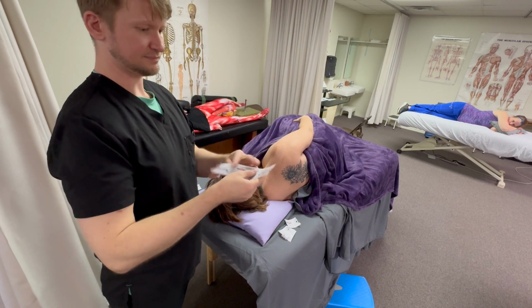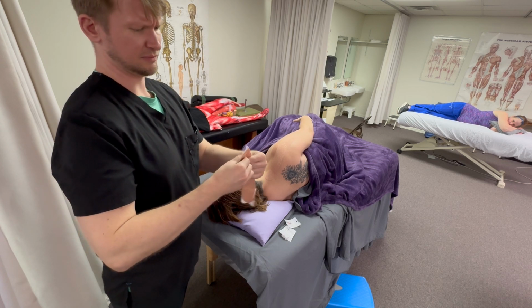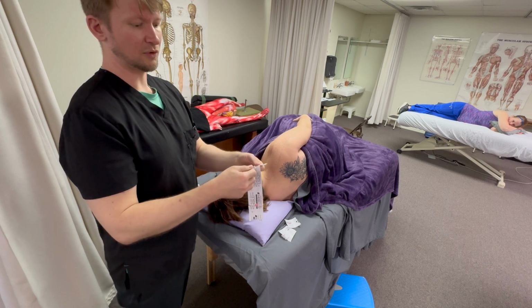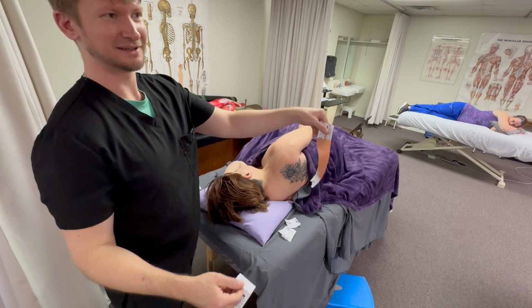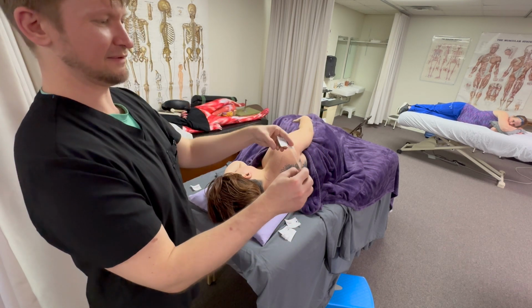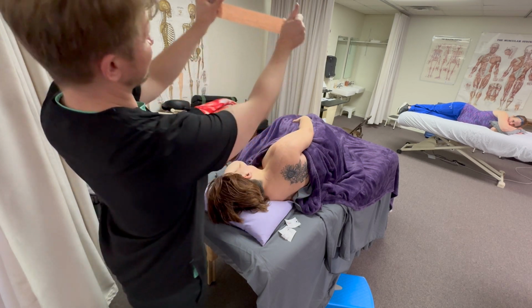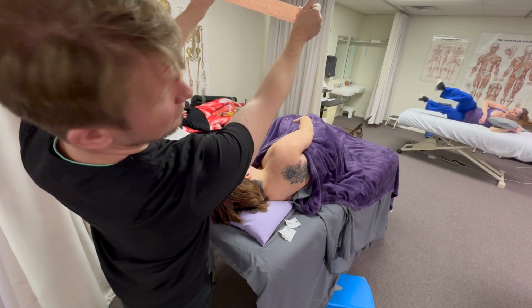So anchor, anchor. I'm going to take the whole backing off and be careful, praying it doesn't suddenly flip and stick to itself. Now I have this. I can stare at those nice little hexagons and go 50% and more.